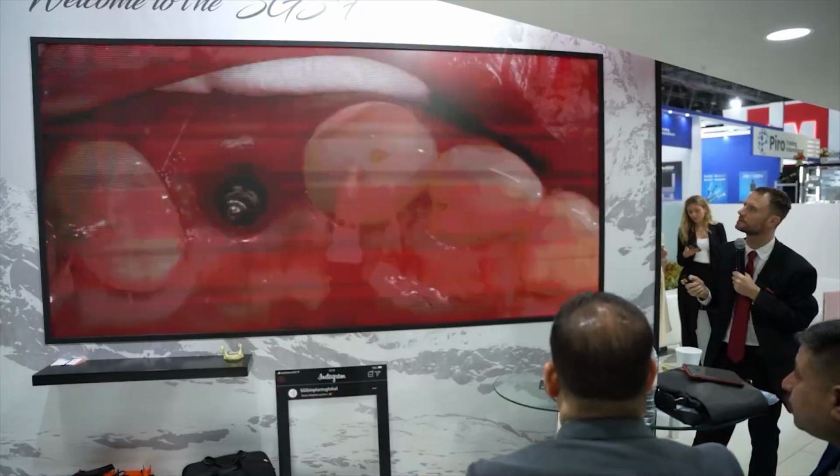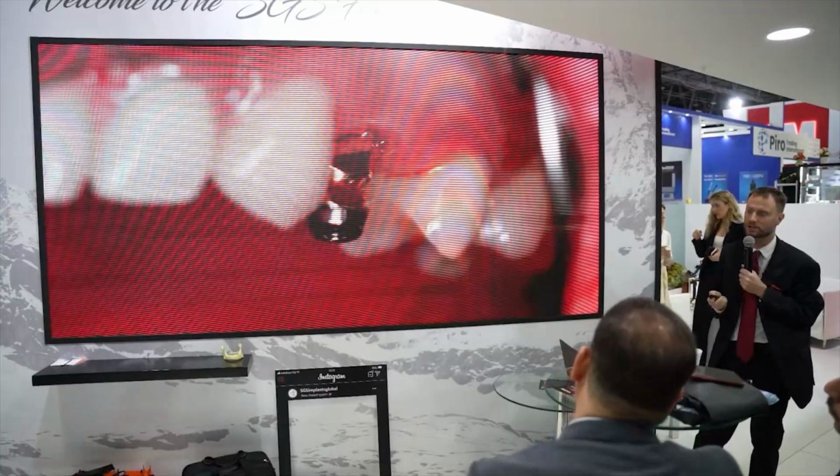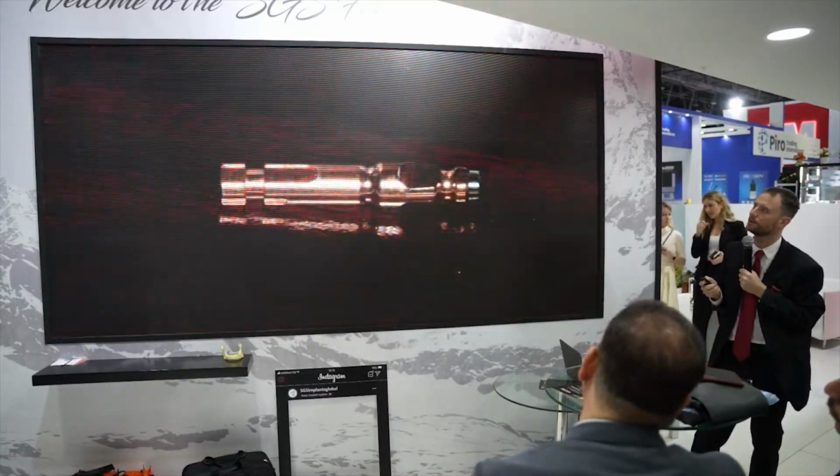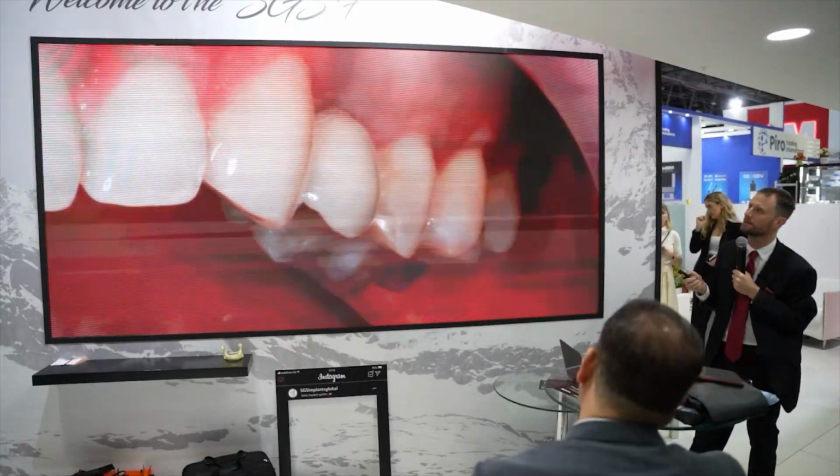And after 3 months, we just remove the healing abutment. This is a different way of impression. And then we go for the final crown. Again, a simple screw-retained crown, nothing extra.